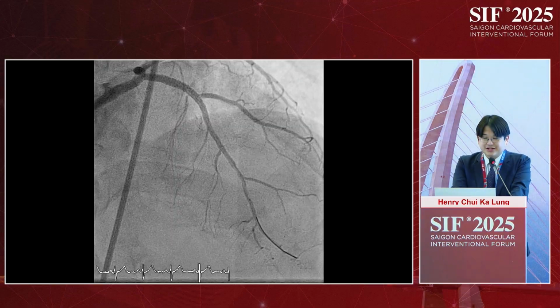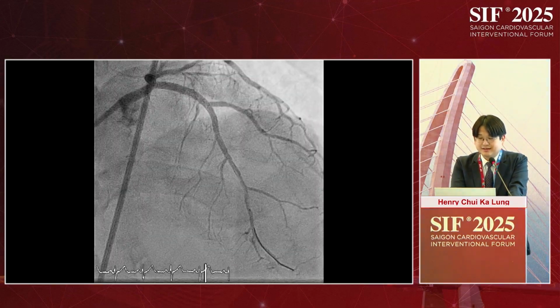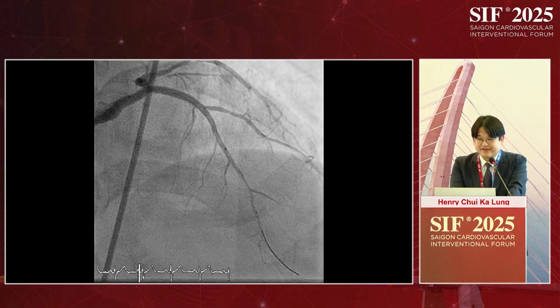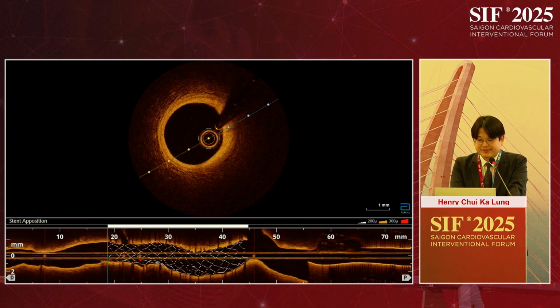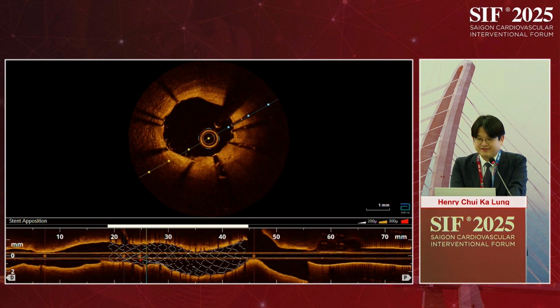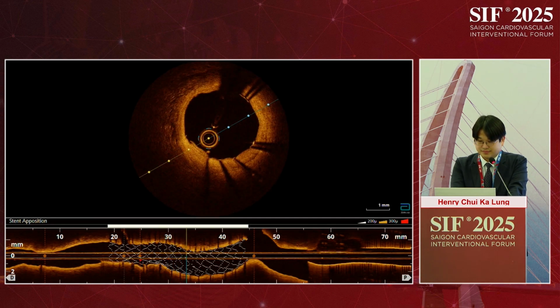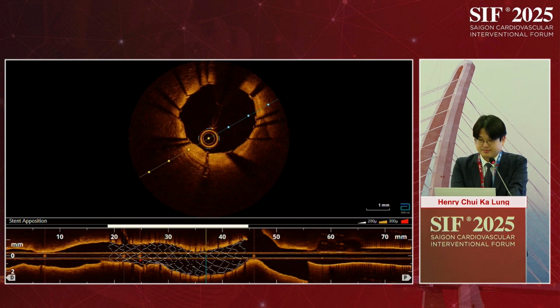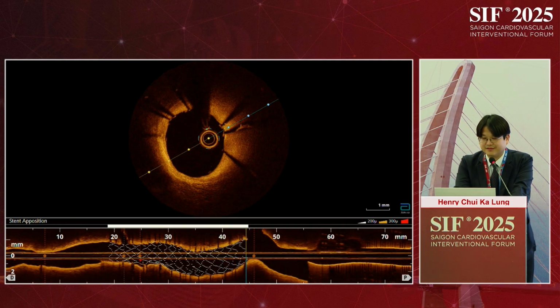We put in one DES, and we did not repeat the post-RFR, but I think there is good stent expansion and apposition of the stent. So we leave the result as such. The stent lands right at the ostium of the LAD.